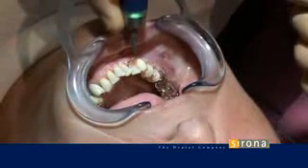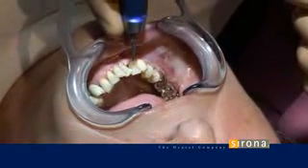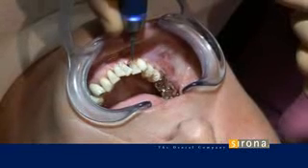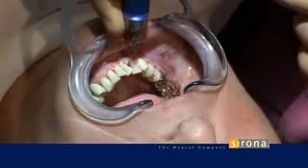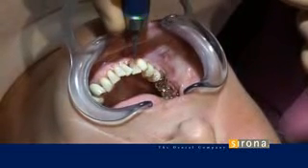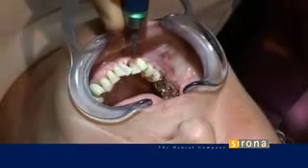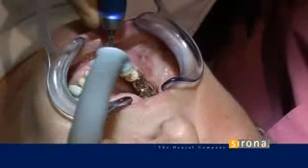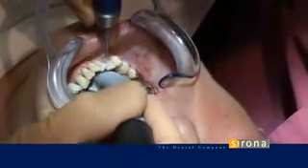Probing is performed until perioscan indicates calculus. First go through the pocket horizontally and then again vertically, so that all areas are covered systematically. Then the unit is activated in order to remove the calculus. Afterwards, the surface is checked again to make sure that all calculus has been removed.